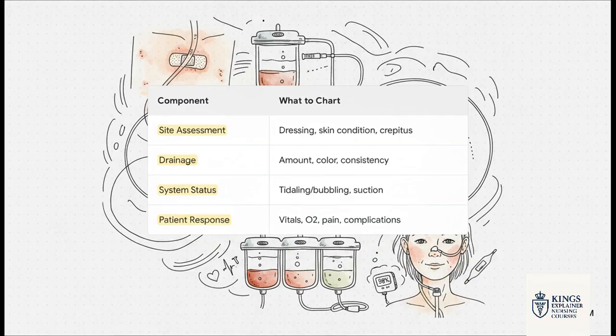You'll chart the system status. Did you see tidaling or bubbling? And of course, you'll chart how your patient is responding, their vitals, their O2 sats, their pain level. It tells the whole story.